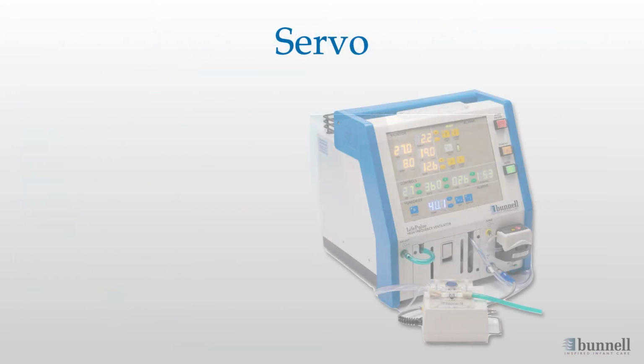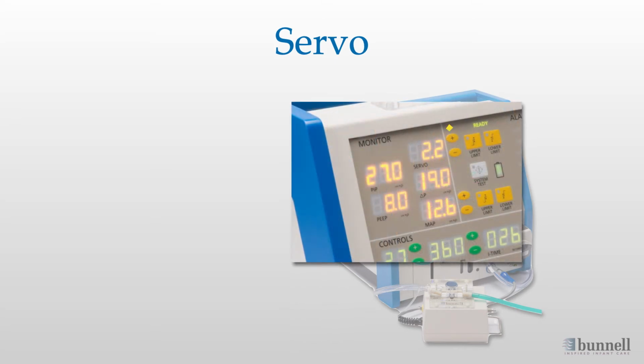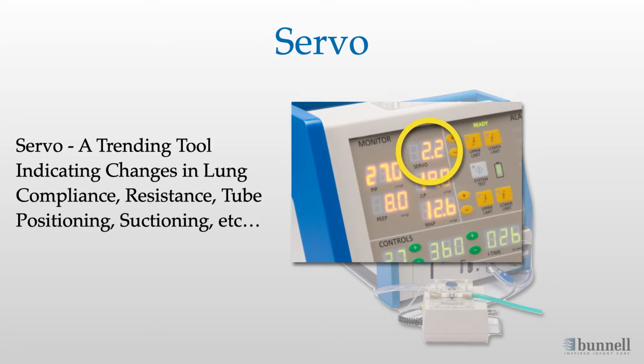The servo value provides trending information about changes in patient status when no changes have been made to either ventilator. A baseline range is determined after acceptable blood gas results have been achieved and small fluctuations are normal. Servo is much like tidal volume seen on a conventional ventilator.